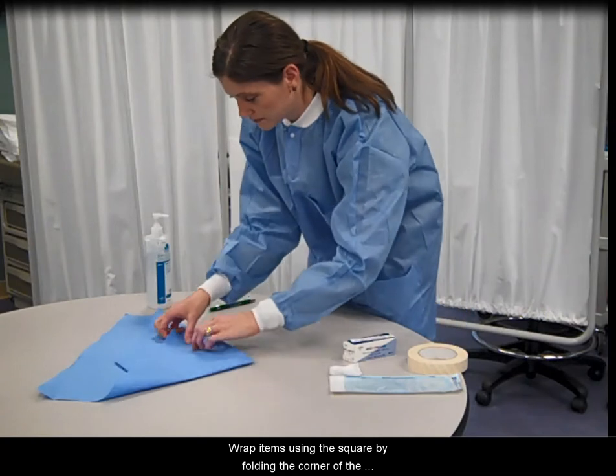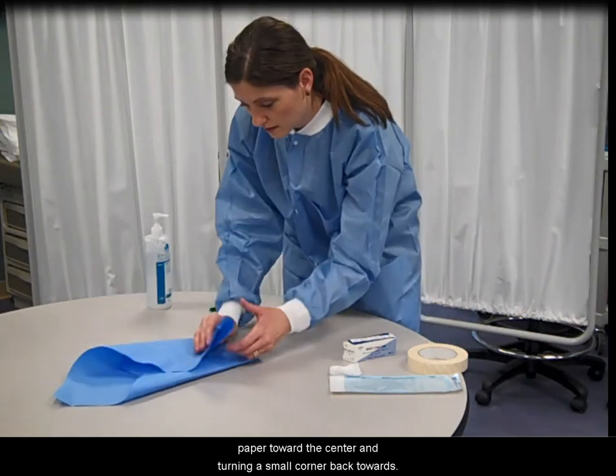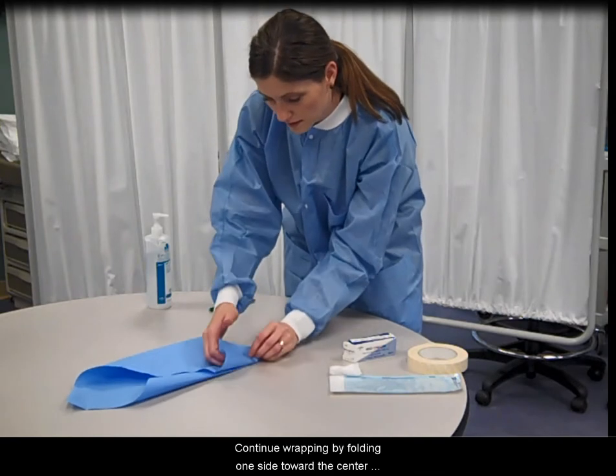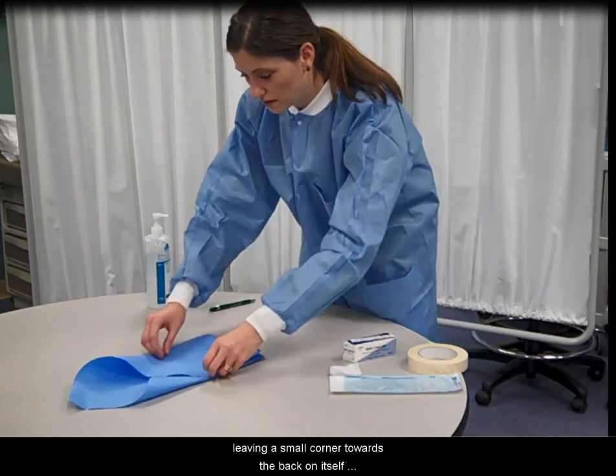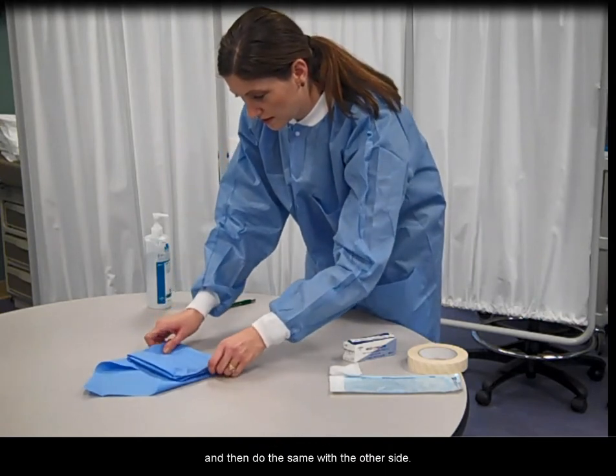Wrap items using the square by folding the corner of the paper toward the center and turning a small corner back toward you. Continue wrapping by folding one side toward the center, leaving a small corner towards the back on itself, and then do the same with the other side.